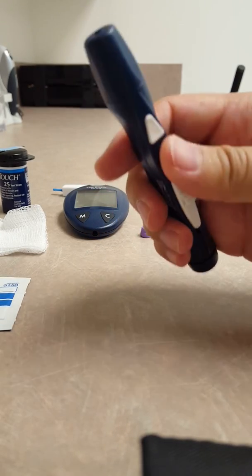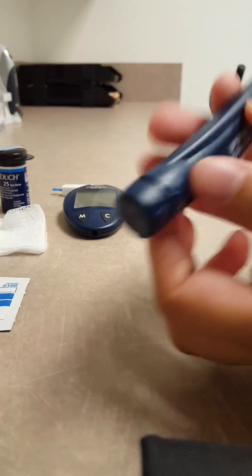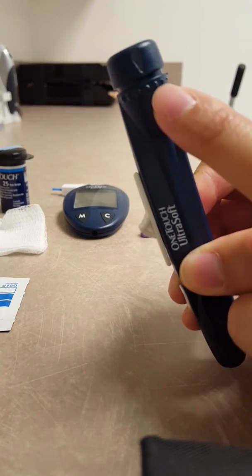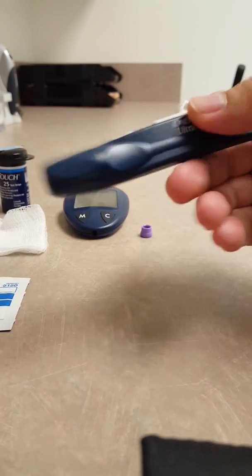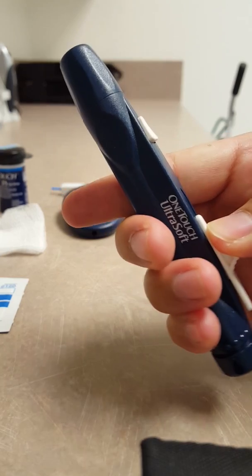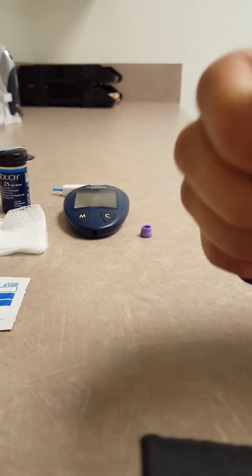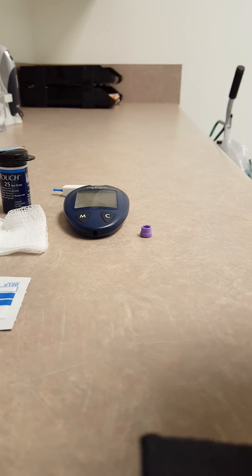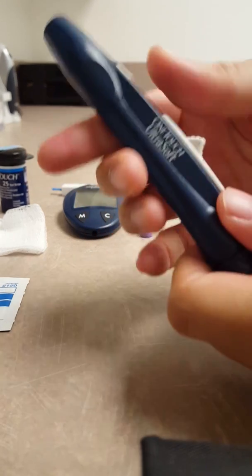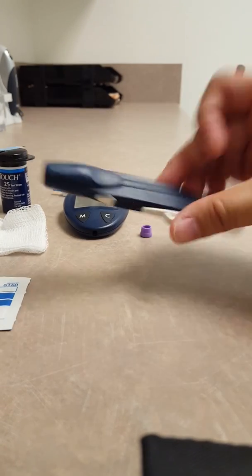So now, as you can see here, we have the dial set to the size of the drop of blood that you want. And if you want to practice with it, you just slide this back to load the spring, and then when you press it you may or may not see that the needle will come through on the other side. So the lancet device is set up.